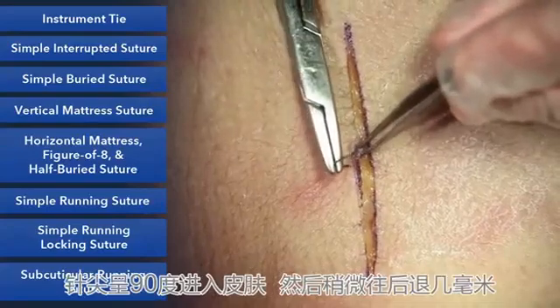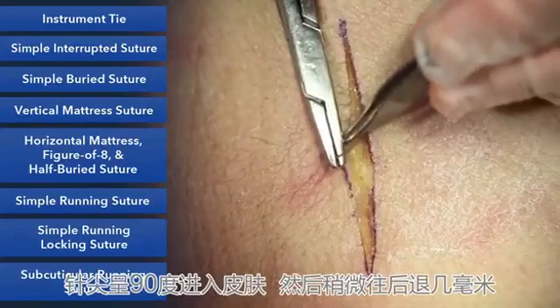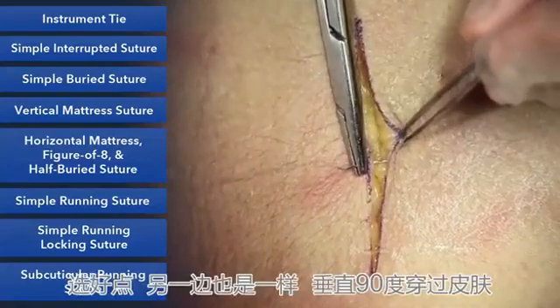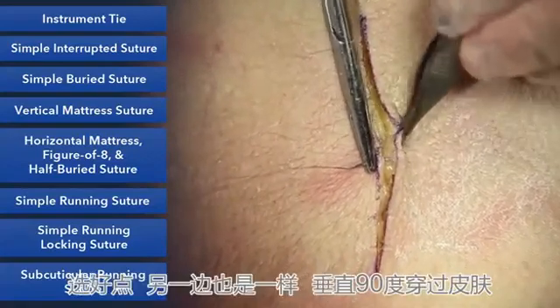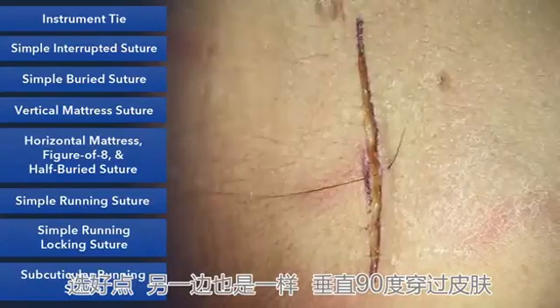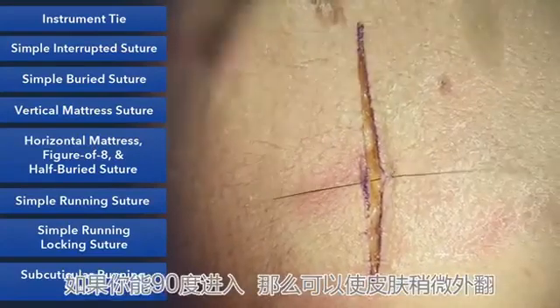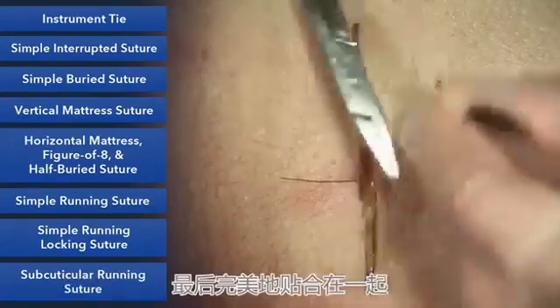A simple bite, we'll want to enter the skin at 90 degrees, and we'll go back a few millimeters from the skin edge and take a nice bite perpendicular to the skin, and then on the opposite side the same, and exaggerate that 90 degrees. If you take it at 90 degrees, the skin edges will then evert and come together nicely.